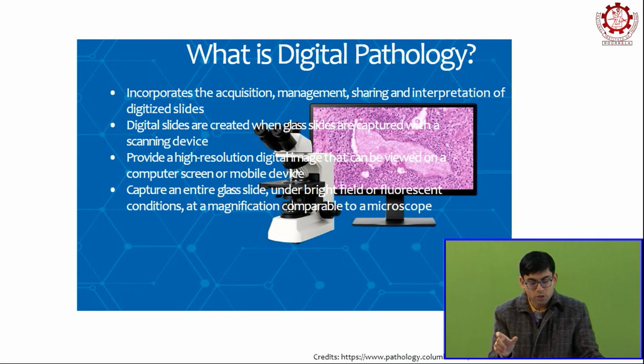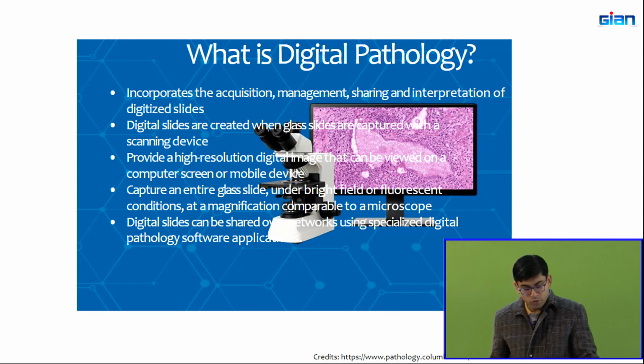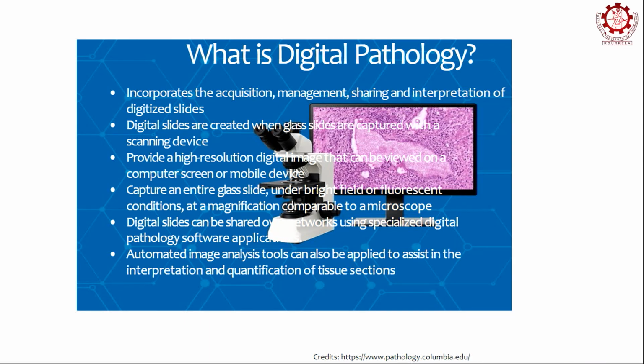So that's when you capture the entire glass slide under bright field or fluorescent conditions at a magnification that is comparable to what you can actually observe under a microscope. And last but not the least, you can actually share it using specialized pathology software applications. Now, the buck doesn't really stop there.